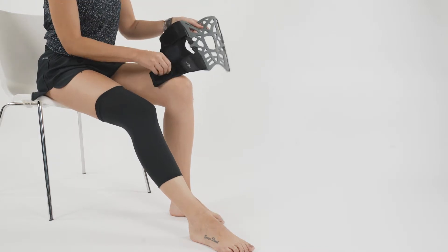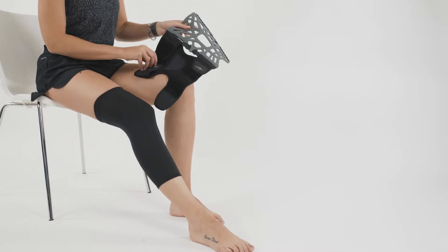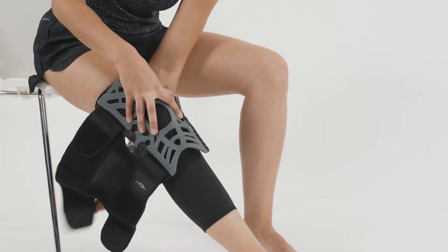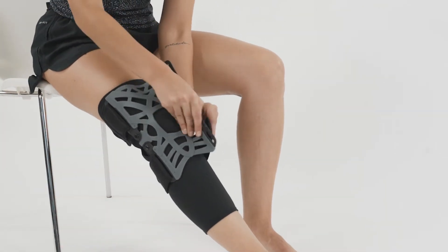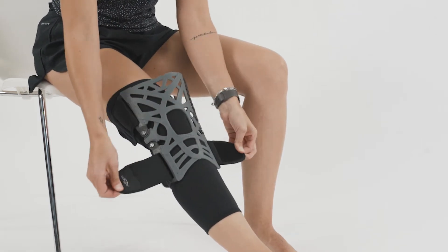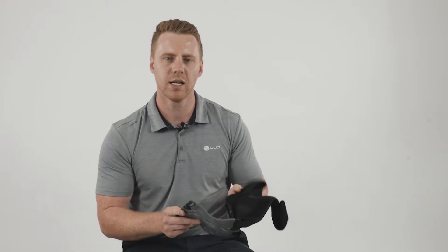The Reaction Knee Brace is a silicone web design that wraps around the patella. This is designed to help disperse compressive forces away from the patellofemoral joint, especially during high loading activities.